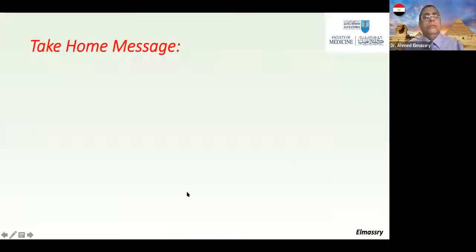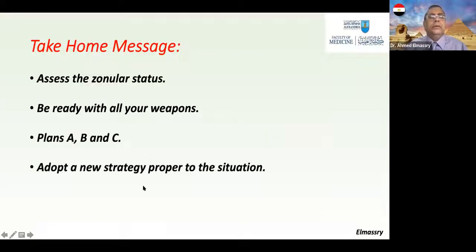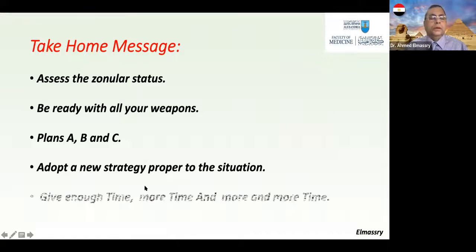So the take-home message is assess the zonular status, be ready with all your weapons. Plans A, B, and C should be ready. Adopt a new strategy proper to the situation. Give enough time, and more time for the patient to have the best results.